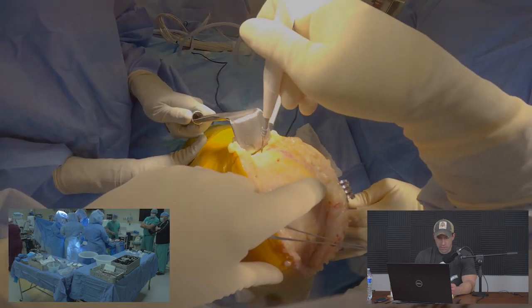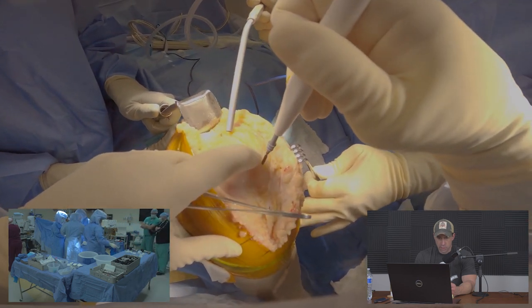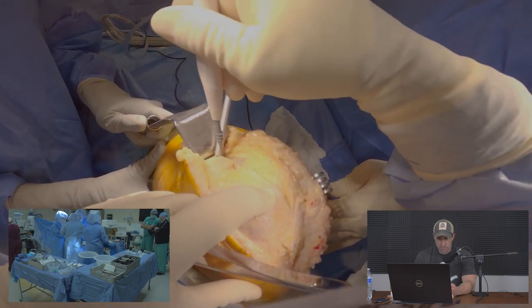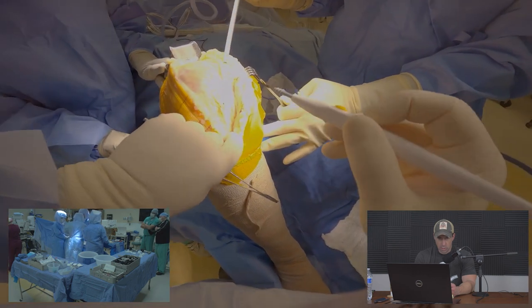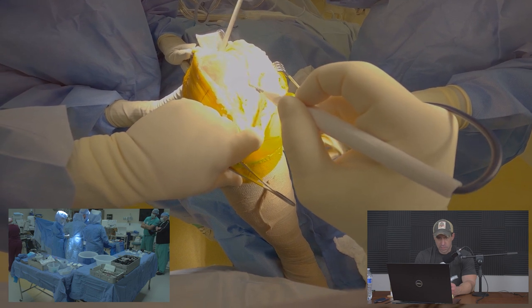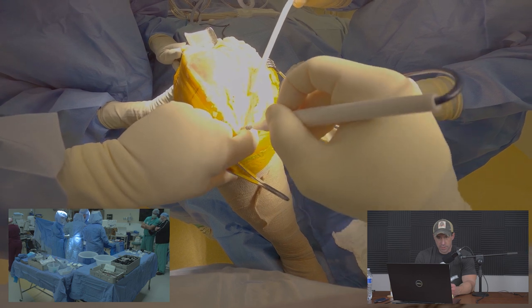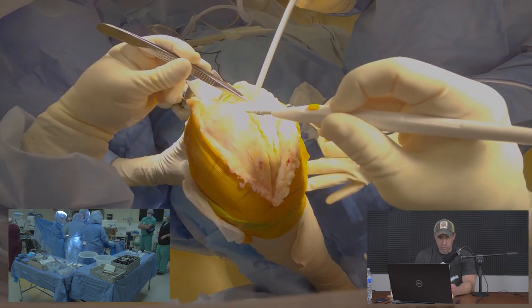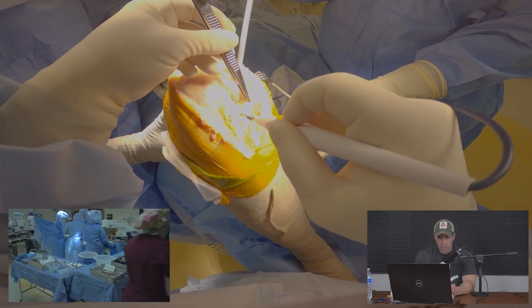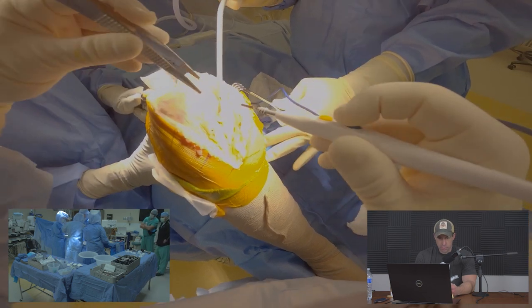This is the arthrotomy — we are entering the joint at the junction between the quadriceps muscle and the quadriceps tendon, coming just to the inside or medial side of the patellar tendon. Here you're seeing us begin to enter the joint and release some more soft tissues for exposure.